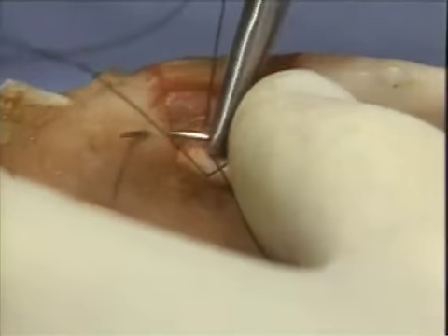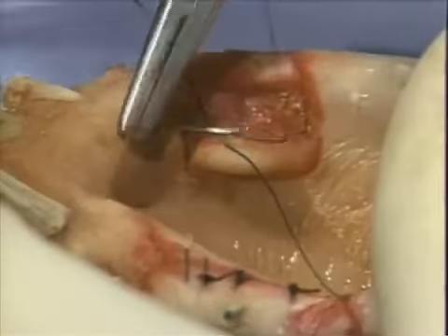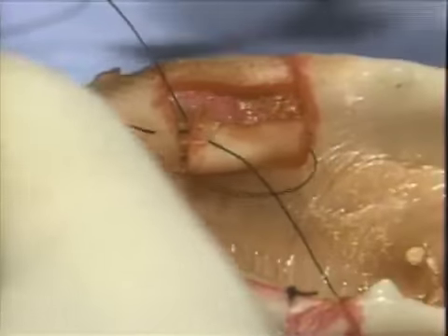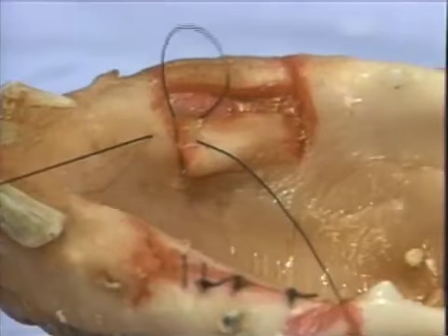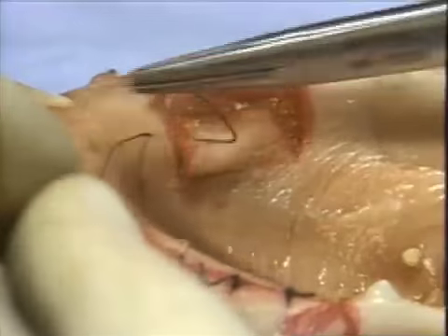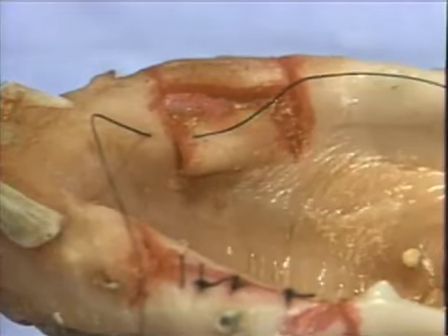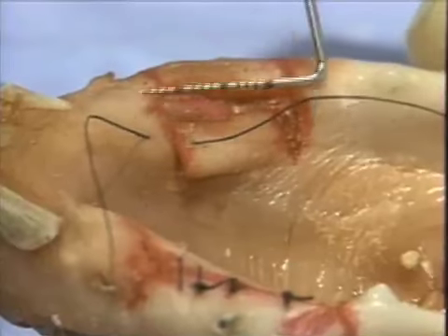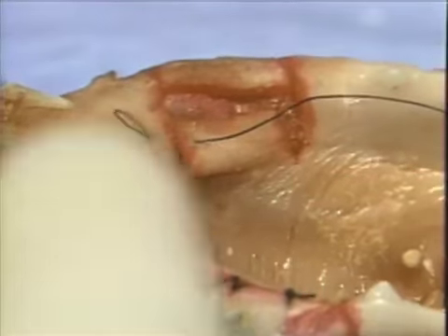We will be using an interrupted loop suture, closing and knotting in a similar fashion, and we'll observe the effect of this suture placement on the final position of the lingual flap. By tying at this position, we have determined the final position of the lingual flap approximately 3 millimeters apical to its original position.